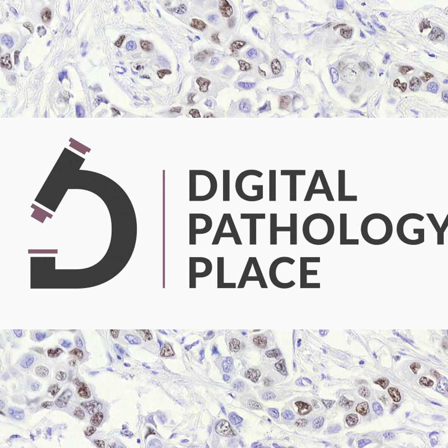Yeah, sure. So there will be two servers. They will be mirrored. So to make sure that it's a kind of security and a recovery security if something happens to one of the two. And there will be one in Finland and one in Sweden. So the basic setup is that we will have 2 copies of all the data, as Julie said. But the repository will be built, the technology will be such that it can also be a federated system. So in the future, we could also have nodes that keep their own data, but are still connected to BigPicture and are accessible through BigPicture.